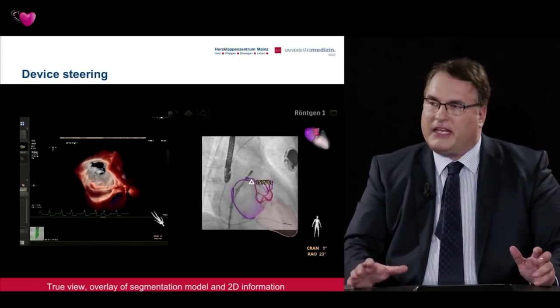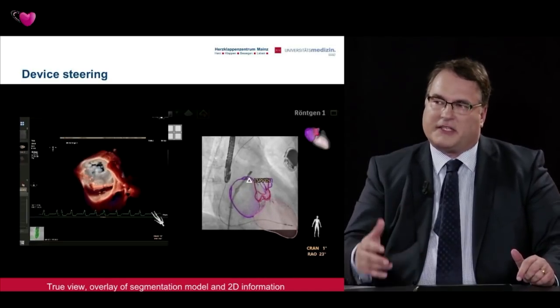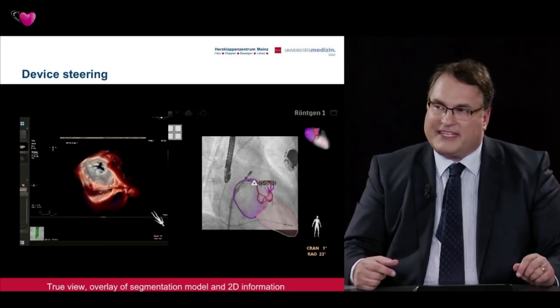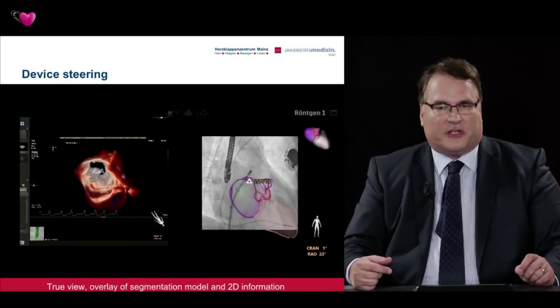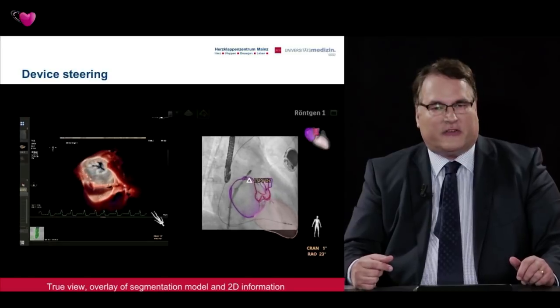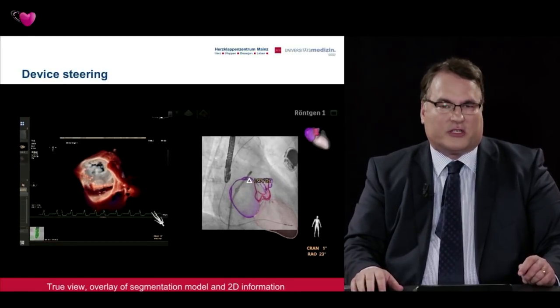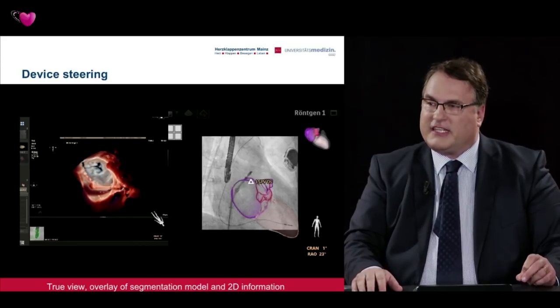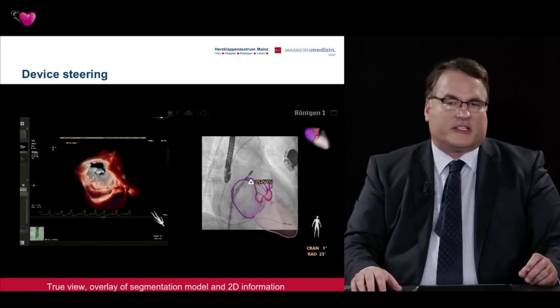and they can come from any echocardiography source. They could come from an ICE catheter, a TTE, or a TOE. And the software was actually developed with the help of Pixar, a Hollywood company, more in cinema productions, like Cars and others.